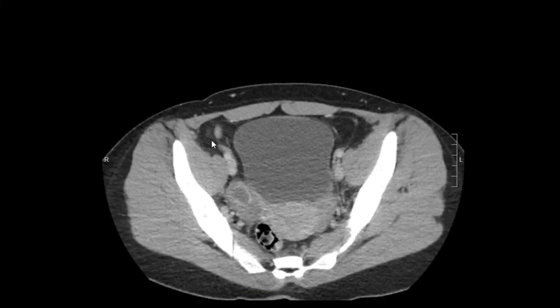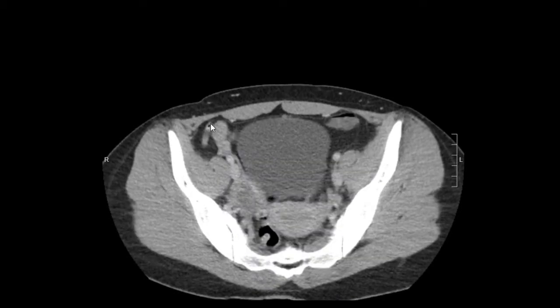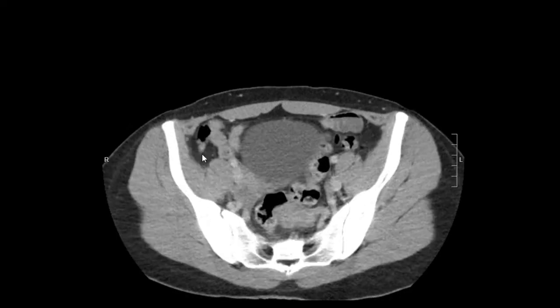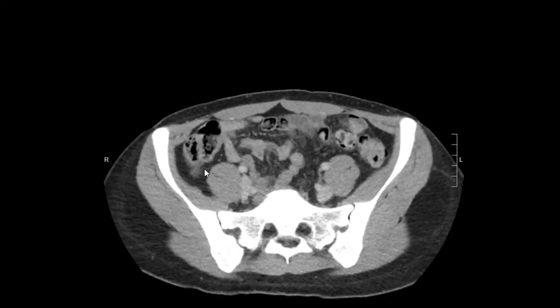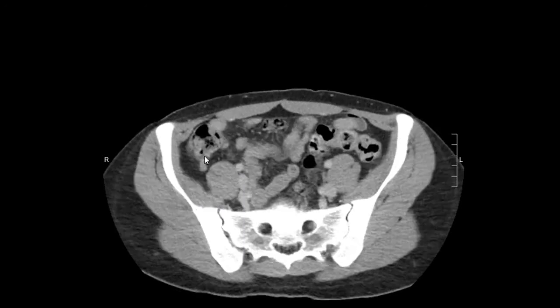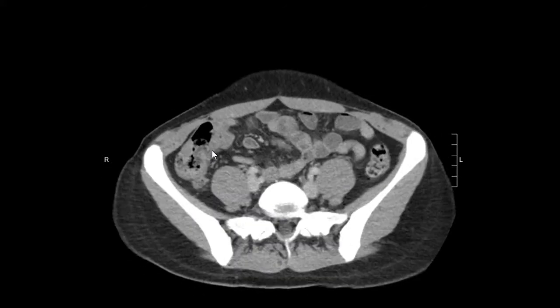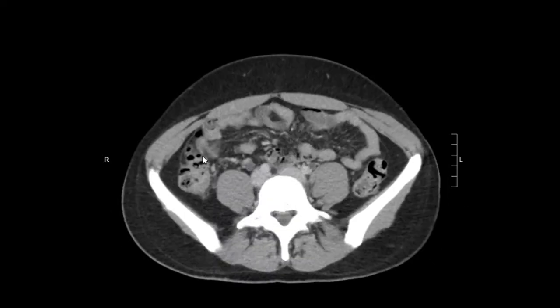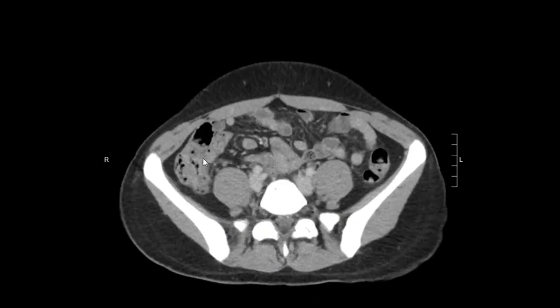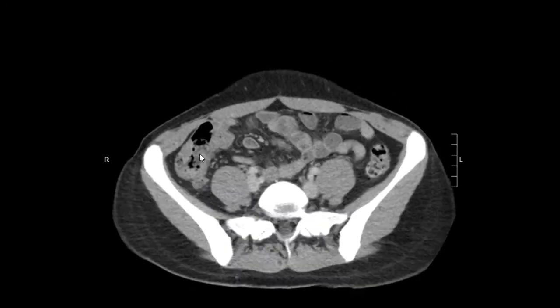Here is the appendix — you can see the blind-ending tube coming right off of the cecum. You can also look for the terminal ileum, and this is it right here. It has a fatty lip — the ileocecal valve. And we can see here is the terminal ileum coming into the cecum and the ileocecal valve.